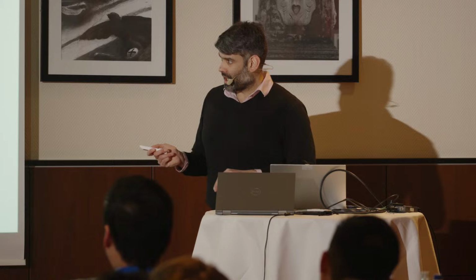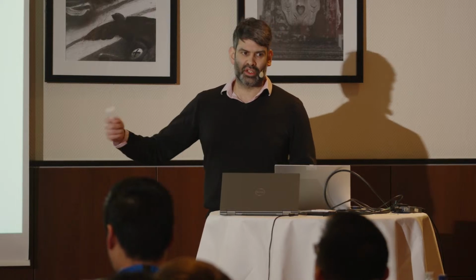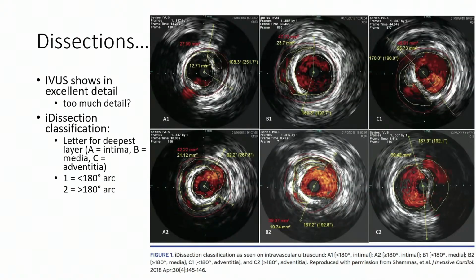To be honest, the main reason I use ChromaFlow is to check for flow after a certain step of the procedure rather than doing another DSA. So ChromaFlow is the thing that has really saved contrast use for me, and I'll show you my workflow a little bit later about how that's done. You can just flick it on at any moment, see that you've got pulsatile flow, and move on to the next step, rather than waiting till the end of your procedure and then finally doing a run.